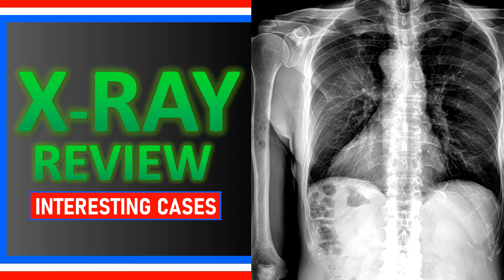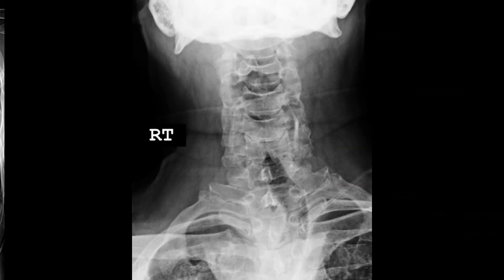Welcome to X-ray review. In this video we're going to go through multiple interesting cases. On this frontal lower cervical view there is a focal deviation of the tracheal air shadow to the left, with an increase in density in the right lung apex. This must be followed up with dedicated chest imaging, as one of the many differentials includes an aggressive Pancoast tumor.